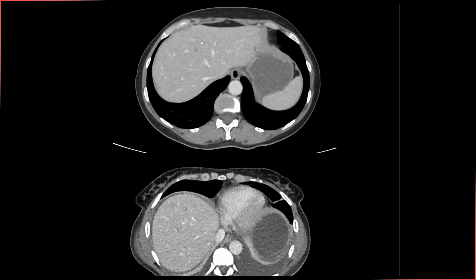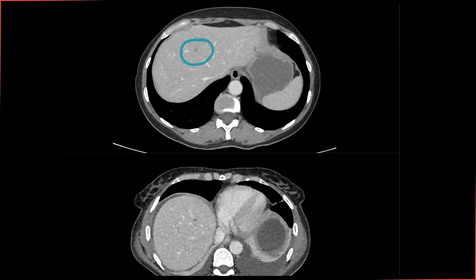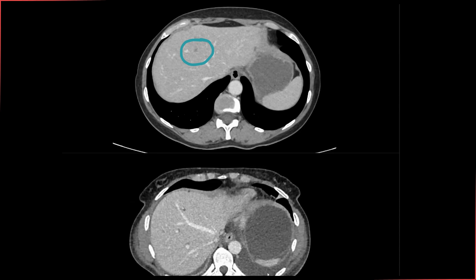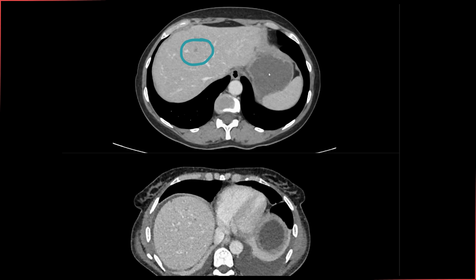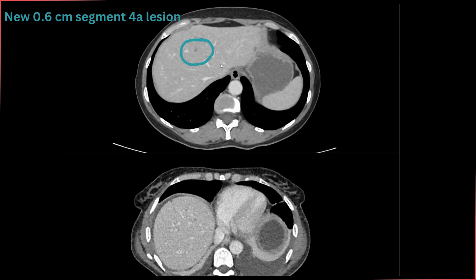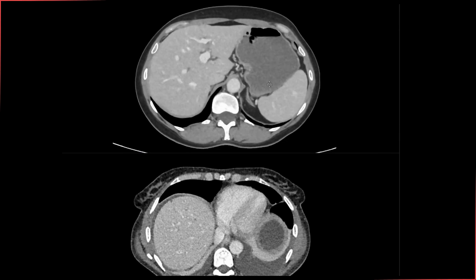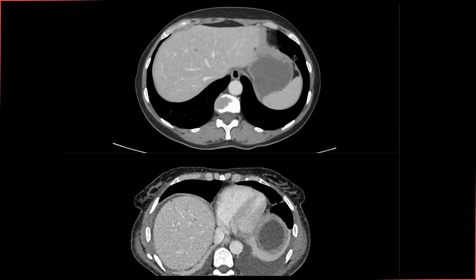However, this lesion in segment 4A is new — it was not seen on the previous imaging. Although it's very small, its new appearance requires further characterization. We measured it at just about 0.6 centimeters, making it very difficult to characterize on CT scan. We ultimately recommended an MRI, which was performed the following week.